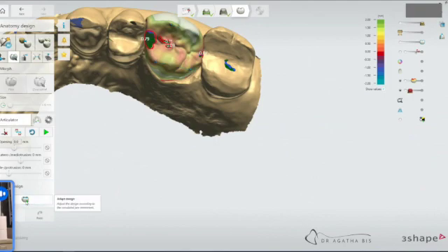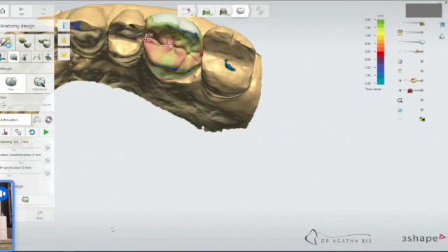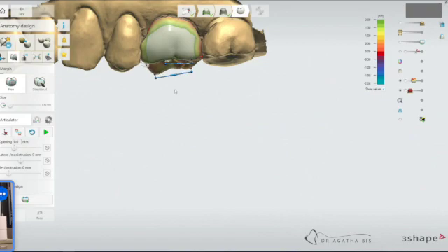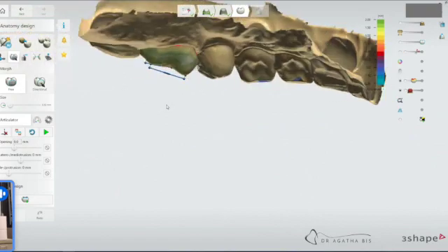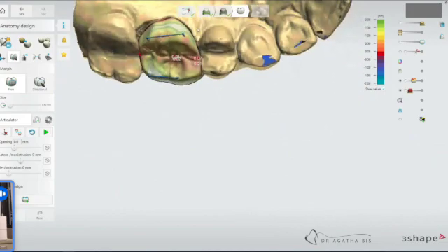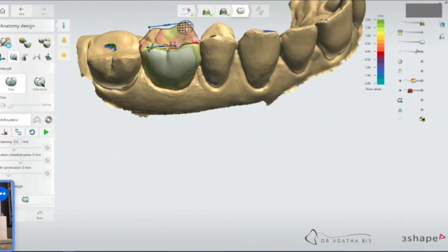You can just ask it to adapt the design to the motion that it detected from the patient. So we're just going to adapt design and then it corrects it. If you play it, you can see that now we're good, we don't have any interferences, even though the cusp is that long. Now I don't like it looking like that. I don't want to leave it that long. So I am going to bring it back up because it looks funny.